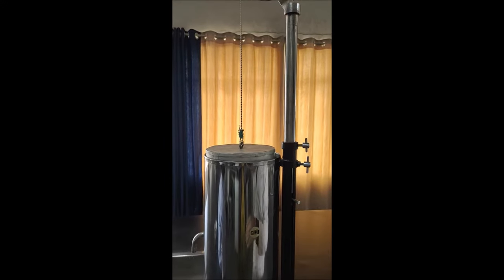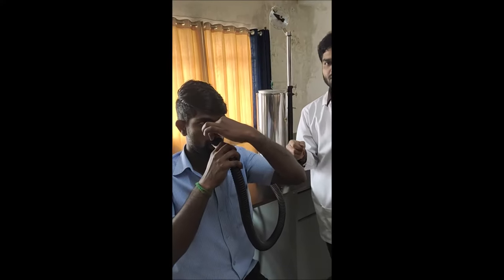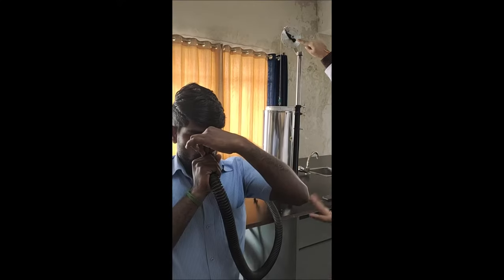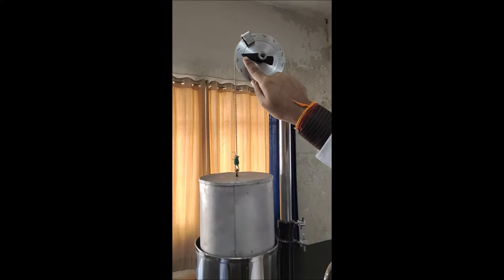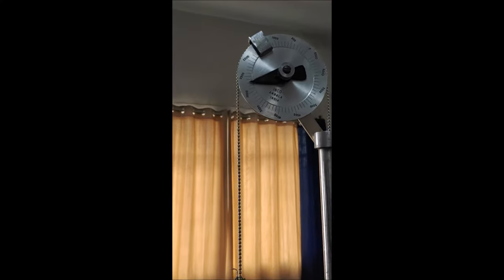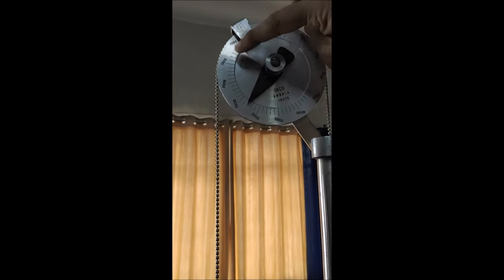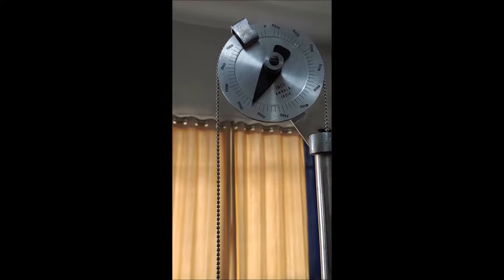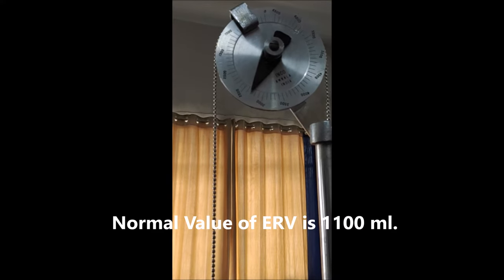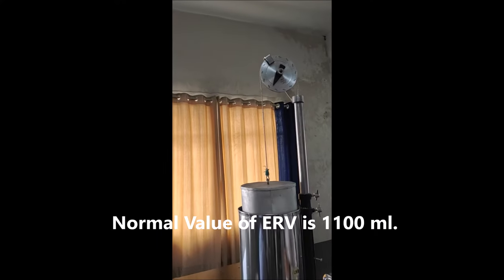Now I am going to do ERV, that is expiratory reserve volume. Keep the mouthpiece in the mouth, close the nose, and forcefully blow the air out. Now come and see the reading: zero, five hundred, one thousand, one thousand five hundred, two thousand, two thousand five hundred — it is coming two thousand seven hundred. So the ERV value is two thousand seven hundred ml.